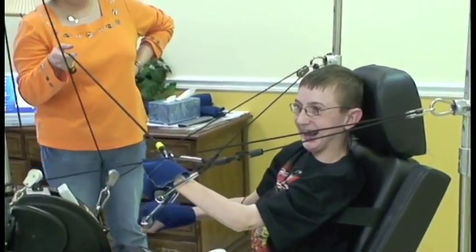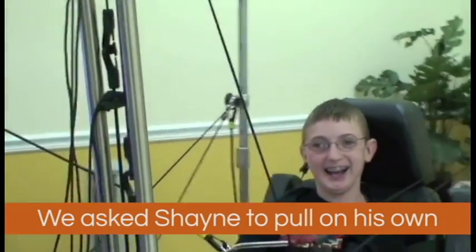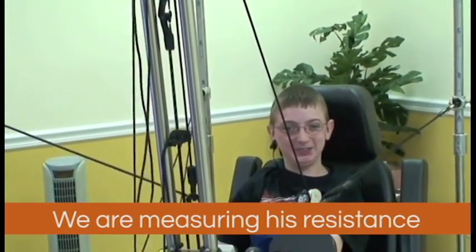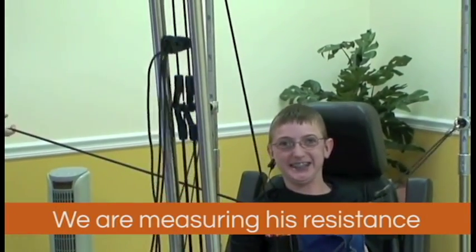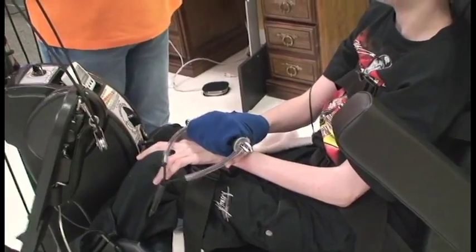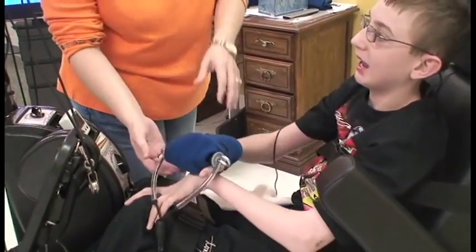Let's see those bungee cords go up real high — come on, go for it! Oh, they're going up there, look at that! His leg won't straighten — he's never done that before. Pick his hands up, let her have your hand there.